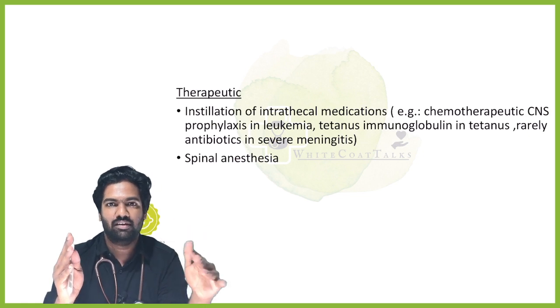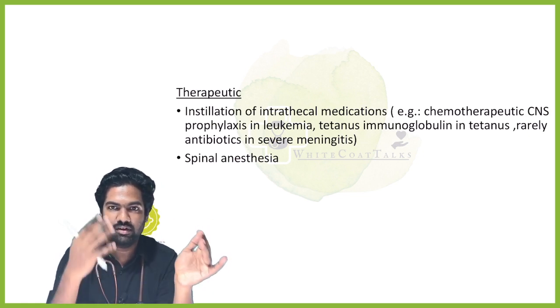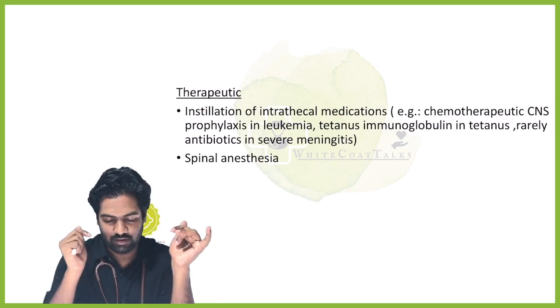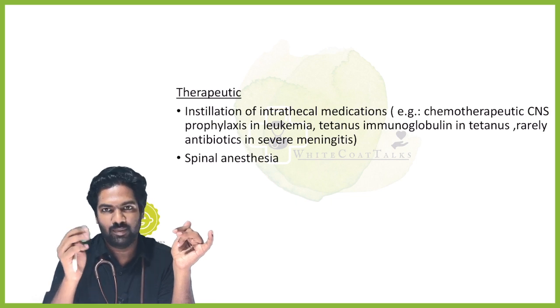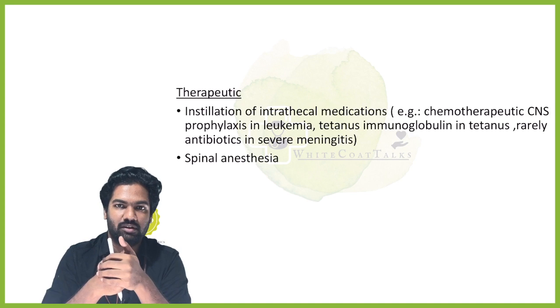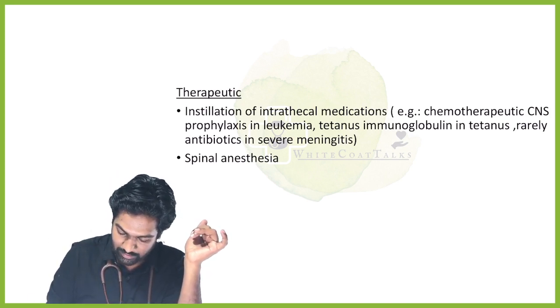Under diagnostic, meningitis and encephalitis are the things we want to evaluate, sir. In Guillain-Barré, there is albuminocytological dissociation. Next, therapeutic. Therapeutic, yes, definitely we can. You have heard of spinal anesthesia. What do they do? They use this needle only and administer drugs. That is intrathecal instillation of intrathecal medications.